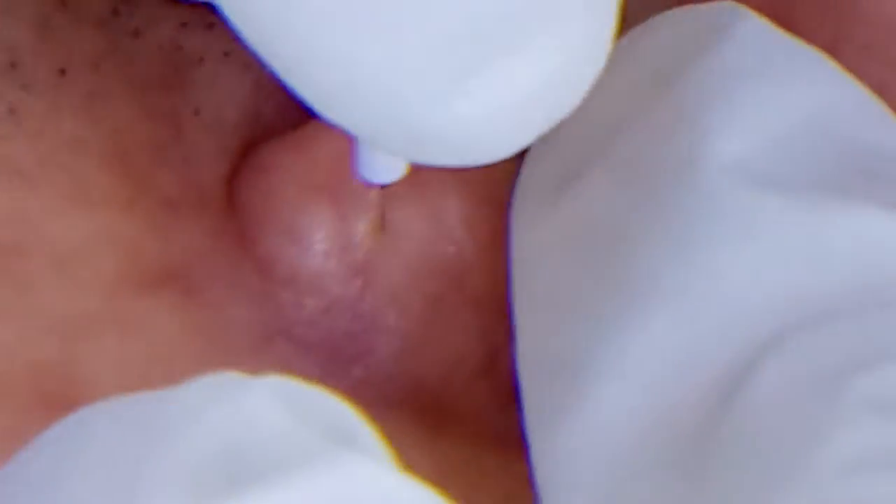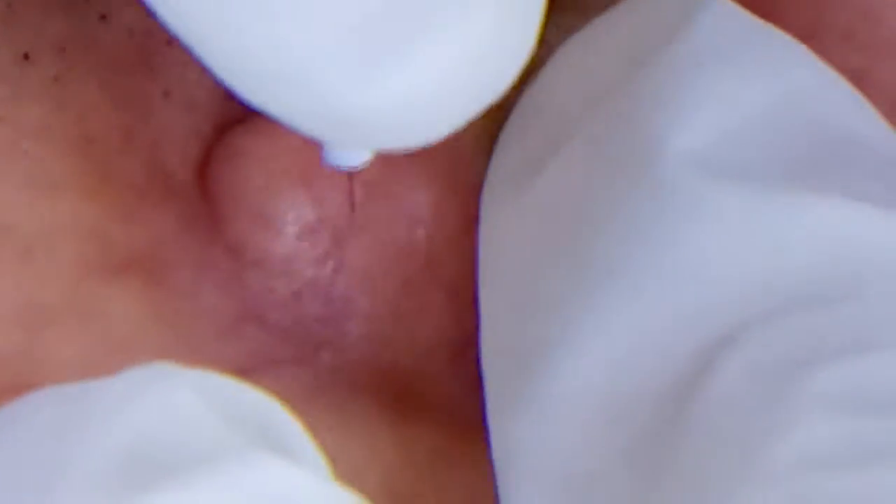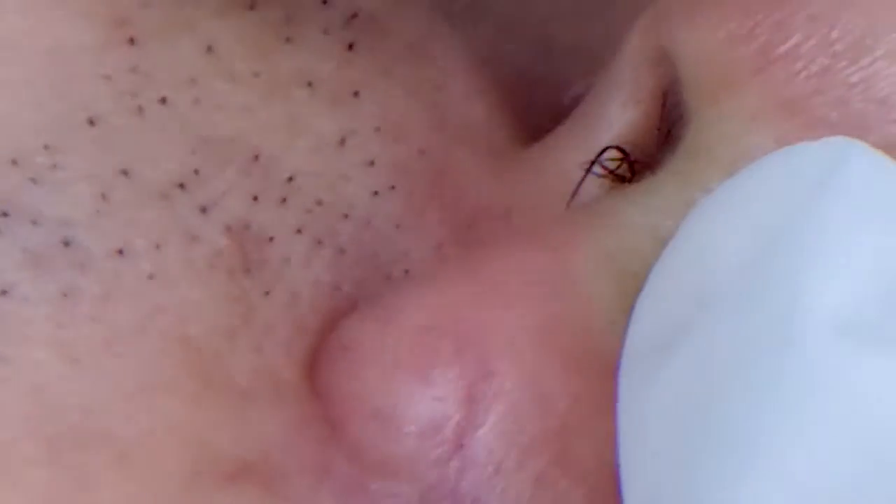Good. Good. Redo that one. Okay, when you see that the probe is not going in, redo it. Good. Good.